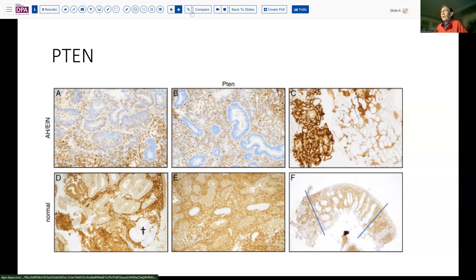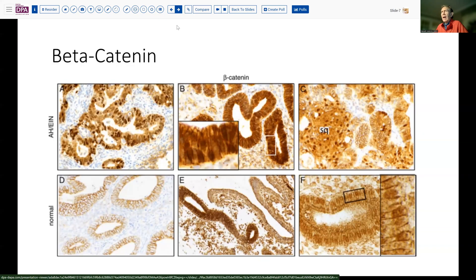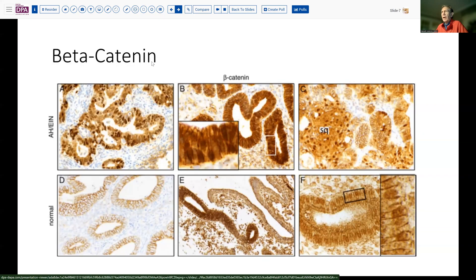Those are the two most frequently used markers. Beta-catenin would be another one, maybe a little bit more tricky to interpret. Generally speaking, strong cytoplasmic and especially cytoplasmic and nuclear staining are associated with dysregulation in this gene, in comparison with normal tissues which may show weak cytoplasmic and occasional strong cytoplasmic staining but generally no strong nuclear staining, as you can see in this third panel.